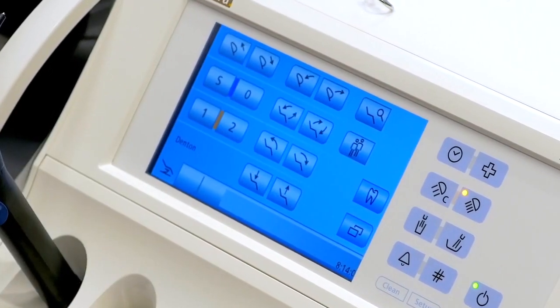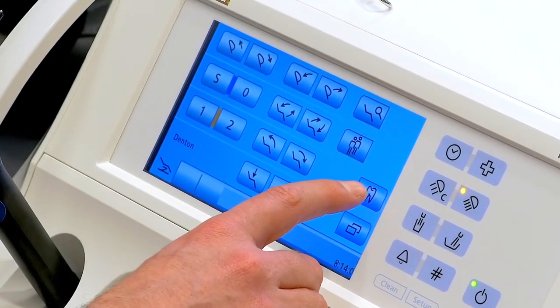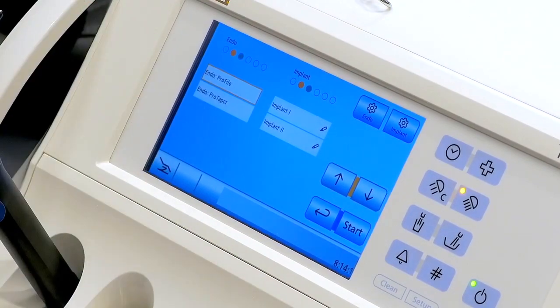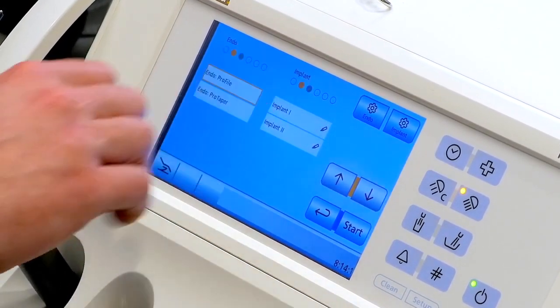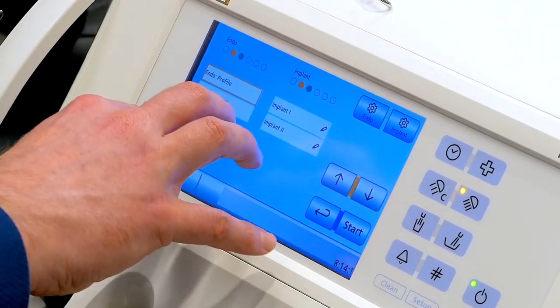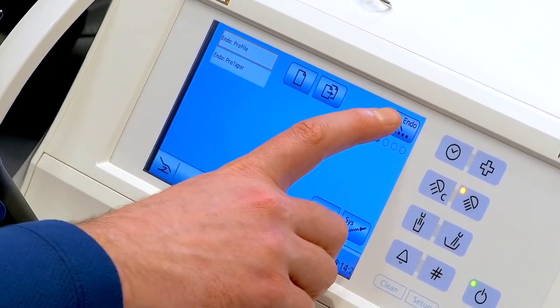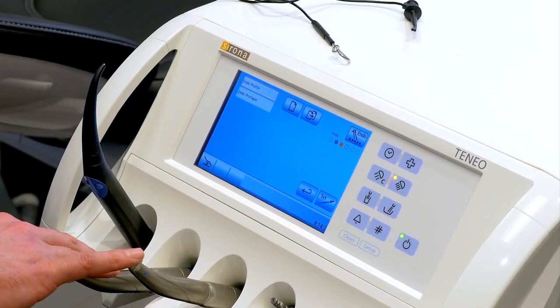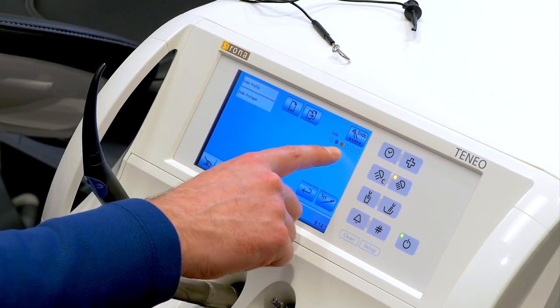After you proceed in getting a working length, you can activate the integrated endodontics by pushing the clinical procedures button with the picture of a tooth on it. Then you're going to go into the Endo menu here. On this menu, you have several different options. When I tap the Endo button, I can then select which position I want to do endodontics on. In this case, we have 2 electric motors, so I can pick which position I want it on.